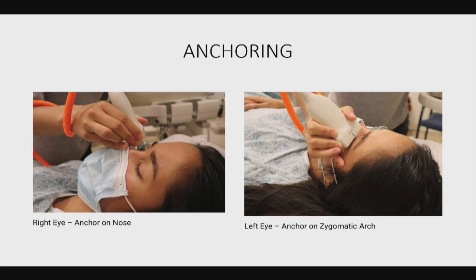As you're scanning through the patient, you want to be able to turn around, press buttons on the ultrasound machine to freeze, get good images and things of that nature. For you to be able to do that, you want to make sure you don't apply tons of pressure to the eye. And to accurately get that, you want to make sure you anchor.